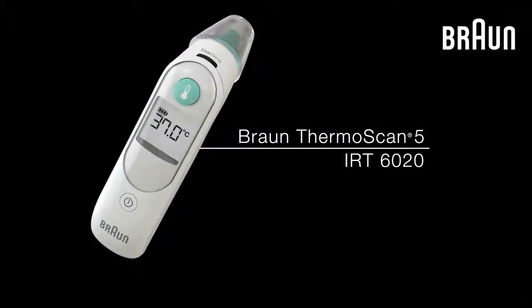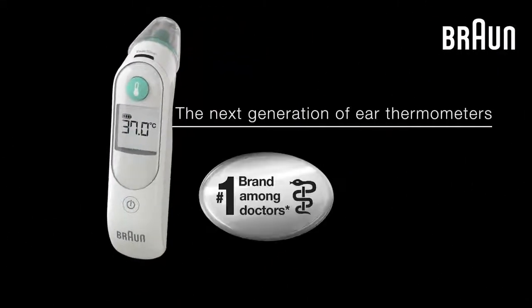Introducing the Braun ThermoScan 5. It's a high-quality ear thermometer with professional accuracy.